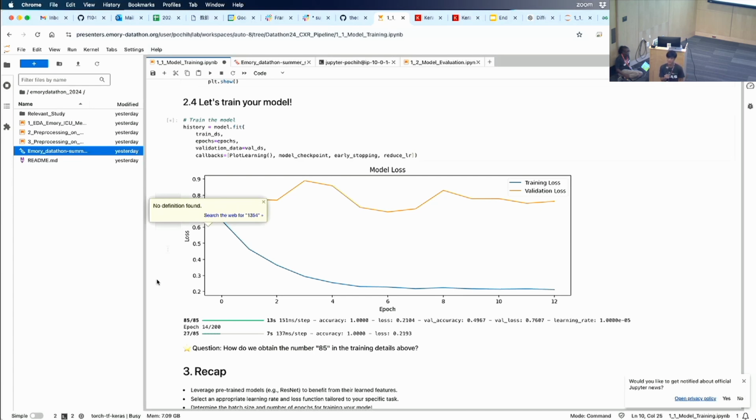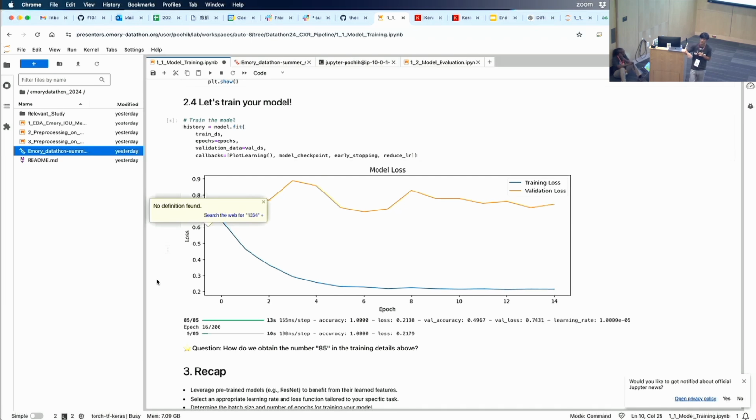Yeah, we'll talk about the distribution in the afternoon session. But right now, I can tell you the number for 0 and 1 is quite balanced. And if you have an imbalanced data set, like you only have 200 images for label 1, then you can consider the method they talked about yesterday. You can try augmentation to increase the training data. And one of the imbalanced data sets will be breast.